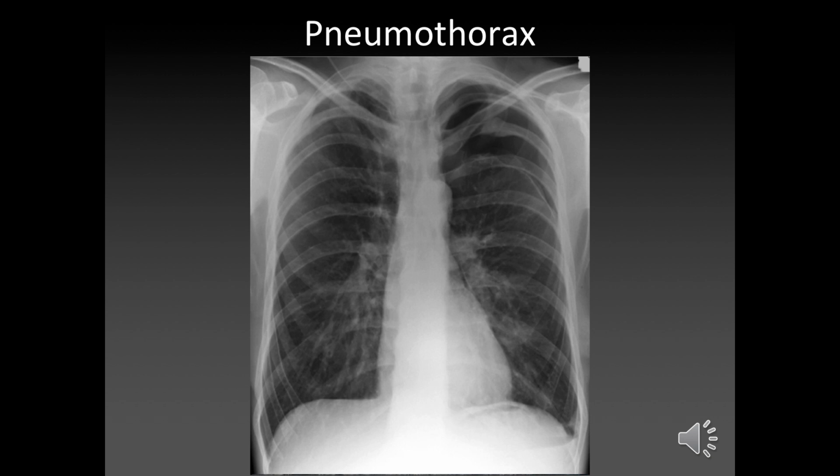We had one, so I was working on ITU a few months ago, and we had a reg who's incredibly good. She's an amazing reg. And she missed one pretty much just like this. But when she looked at it again, and you told her where it was, she couldn't believe that she missed it.